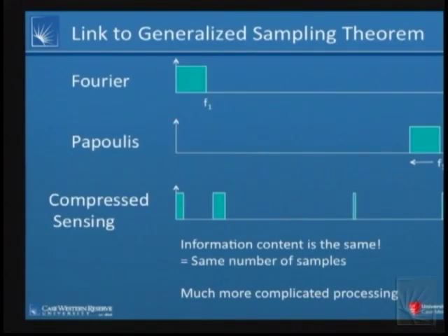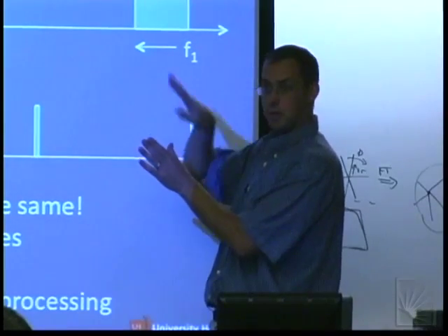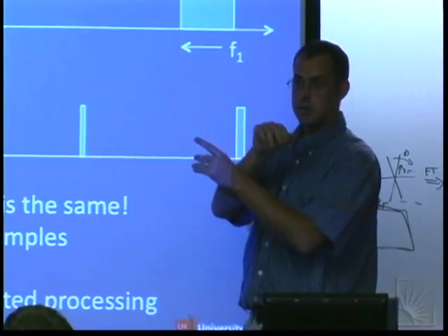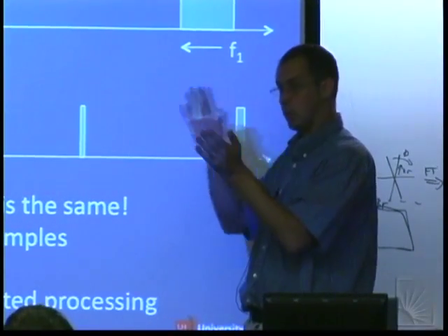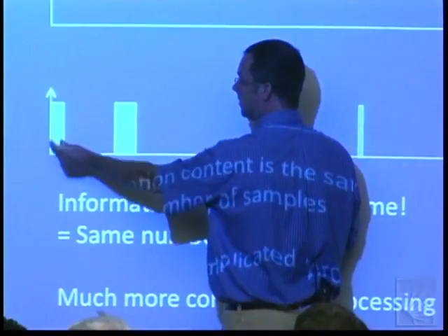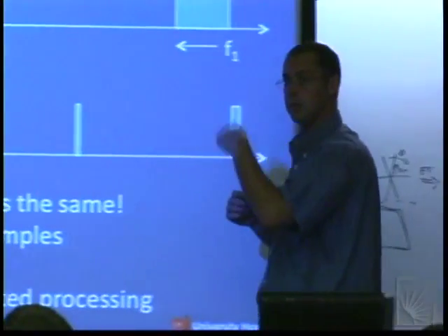So I would collect the data, and it would have a bandwidth corresponding to this, for example. So call it 100 hertz, just for now, right? Sure. I could reconstruct that 100 hertz bandwidth, and if my data comes all the way out to here, it's just going to be aliased by a factor of 10, say, right? What we're doing specifically in this GST MRA processing, which is just one of many, is saying I know that this portion of that bandwidth belongs there. I know that the next portion belongs there. Just literally, it's an assignment process.